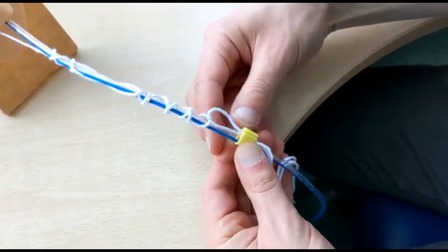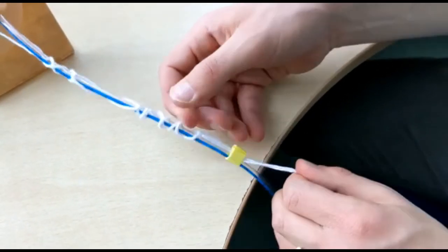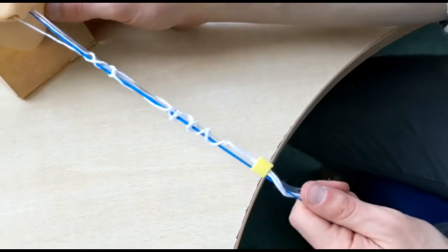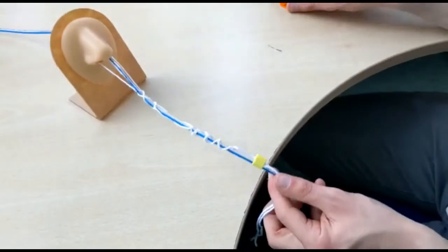The clip can now be applied. This should be attached far away from the patient's face to prevent pressure sores, particularly in patients who will need proning.